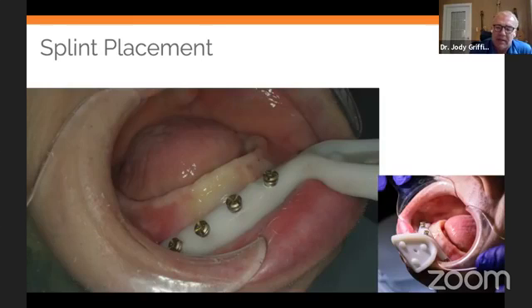And it's really atraumatic as opposed to opening the tissue from ear to ear, reflecting the tissue all the way down the angle of the mandible, and then having to suture everything out of the way, put the guides in. That takes how much time before you can actually start the surgery? Quite a bit of time, where this is 2 minutes and we're jumping right into the osteotomy.